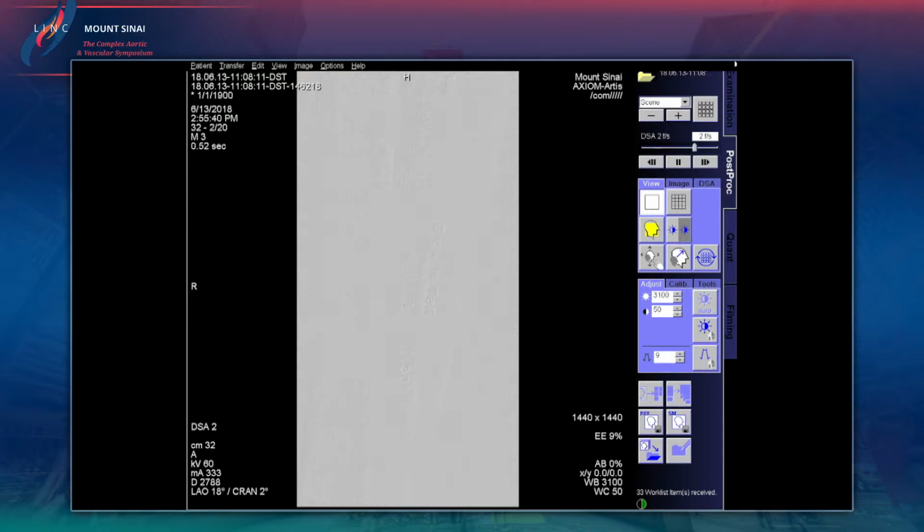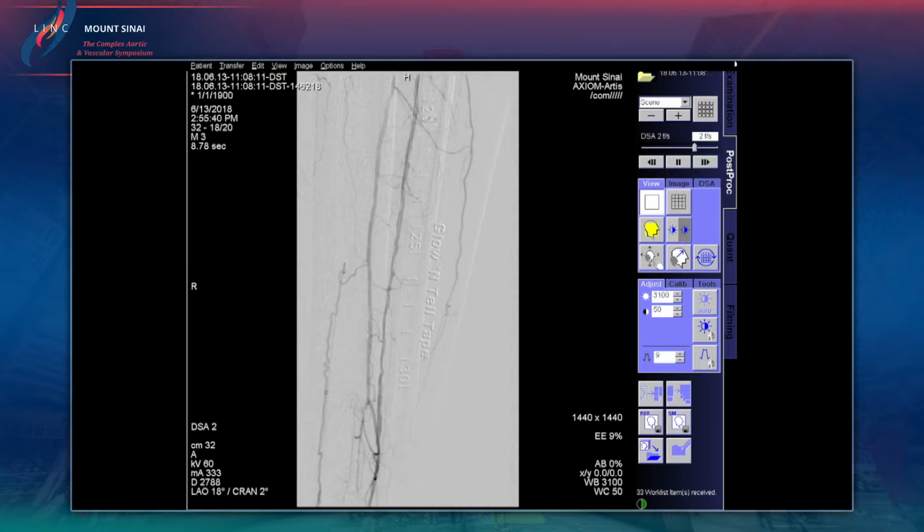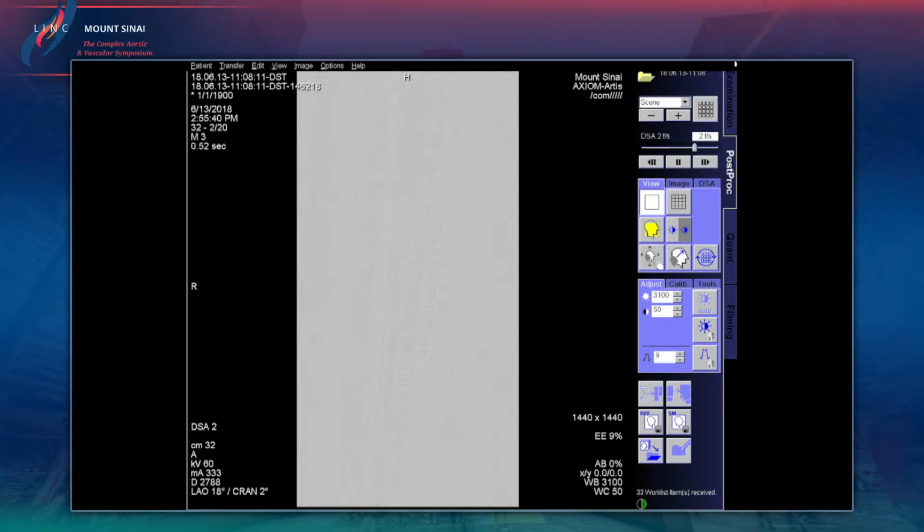The reimbursement issues are real, but at the same time, I do not want to put a DES down here for all the reasons that George said. Unless we come up with a nice self-expanding DES, it would be nice. But here you're going to have to put four or five or six of these DESs, which is something we really don't want to do.